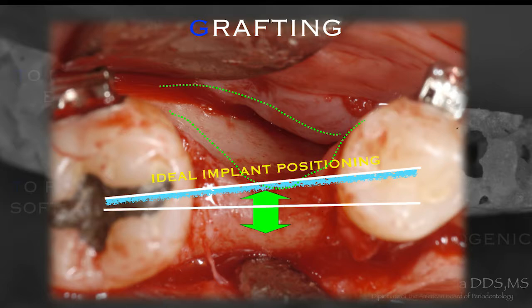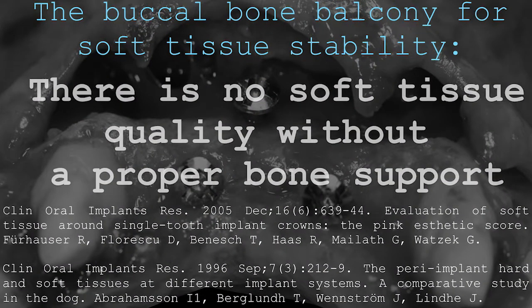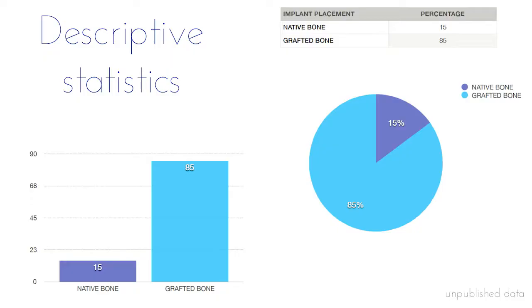Maybe we have an option to use different surgical technique for bone grafting. So overall, we are going to look together at some cases with increased difficulties in terms of bone augmentation, and now I do use the Osstell measurements to improve my self-confidence, because confidence really is the most important keyword today. The soft tissue, again, is supported by the bony architecture. I need to share with you my statistics. I have to place implants in augmented bone about 85% of the time. So I'm dealing with native bone in less than 15% of my implant cases.